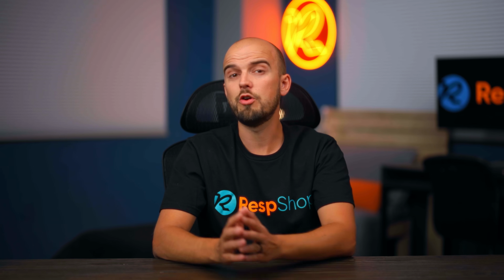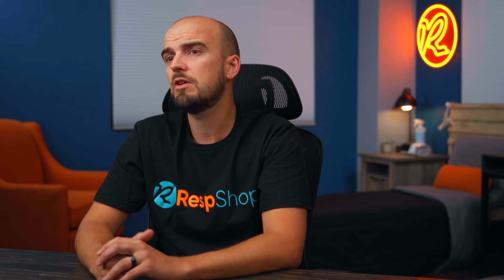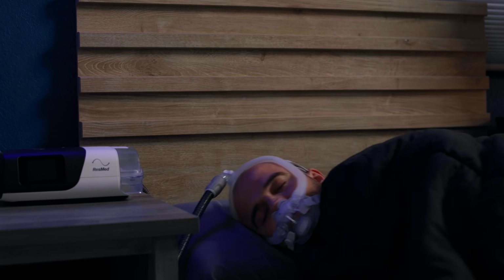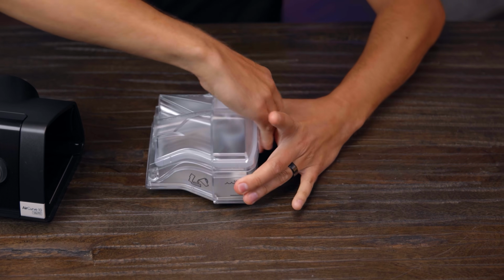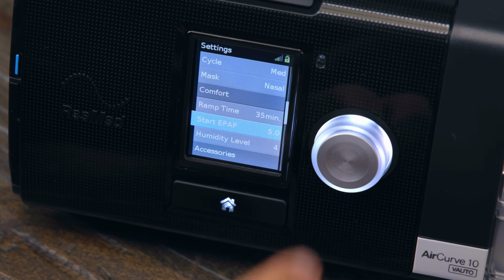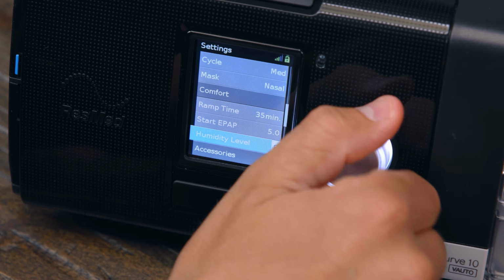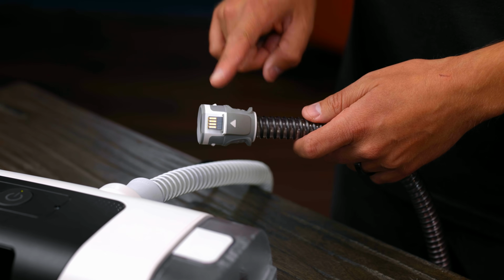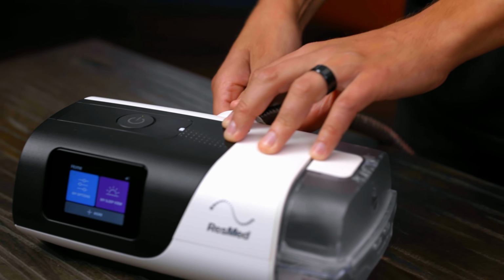But dry mouth might not be, or not just at any rate, because of mouth breathing. It can also be because the air coming from your CPAP is dry and cold. To fix this, make sure you have a good humidifier and the humidity settings are right for your sleep environment. These settings can easily and safely be adjusted in your menu without needing to consult with your doctor. And if you don't have a heated tube, getting one of these can really help keep the air warm as well as moist, which helps to avoid dry mouth.